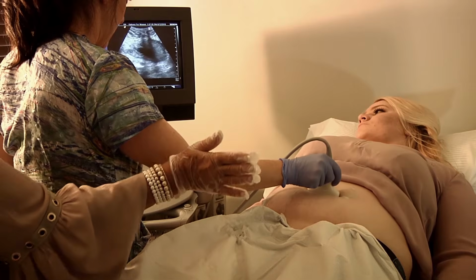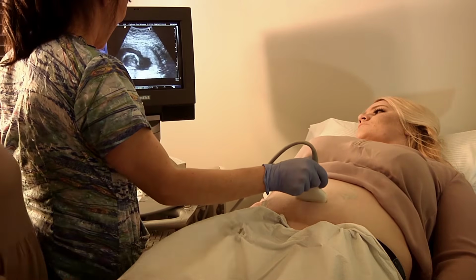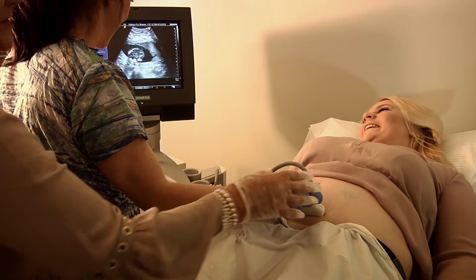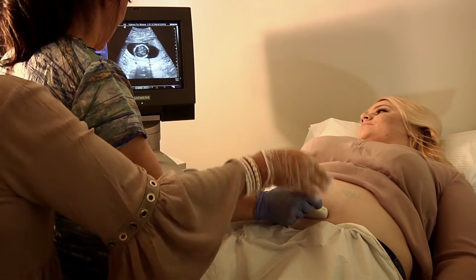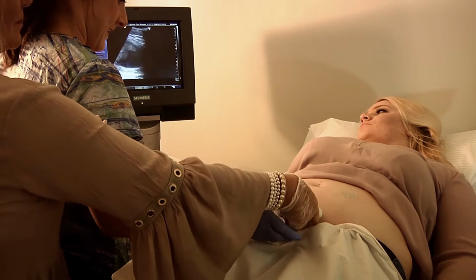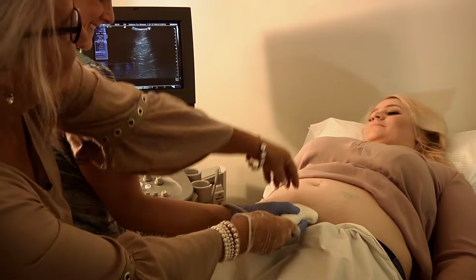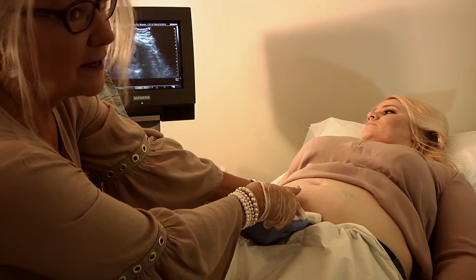Okay, and then she's going to come back. And I'm just going to bring your depth down a little bit. And then you would just take a transverse somewhere in the middle. Now she's got her probe backwards, so she's got to turn it this way. One way to test that is to take your finger, and your finger should be on her right side.